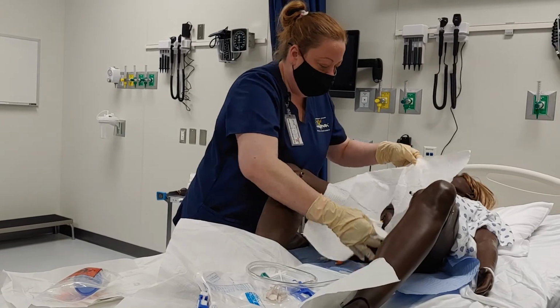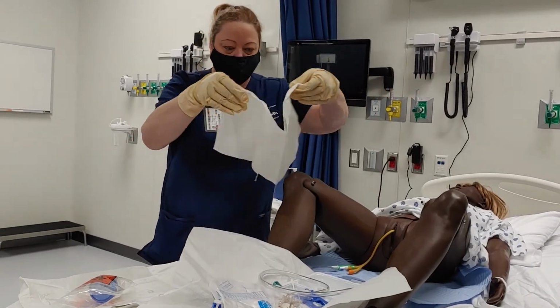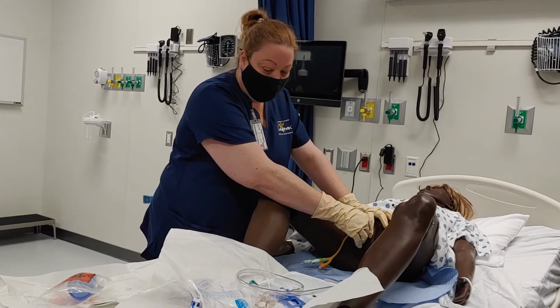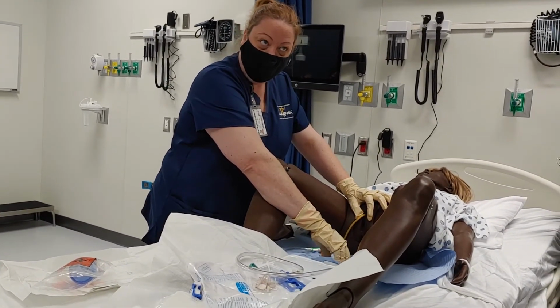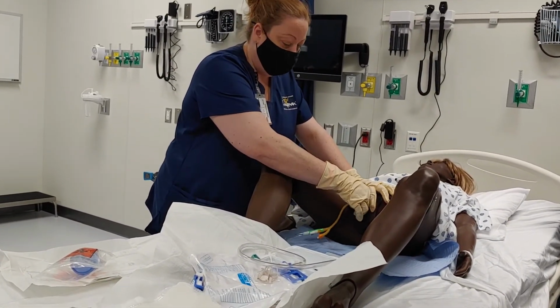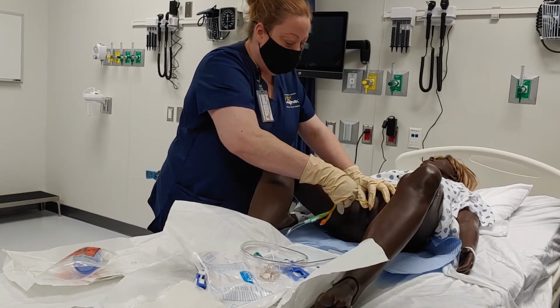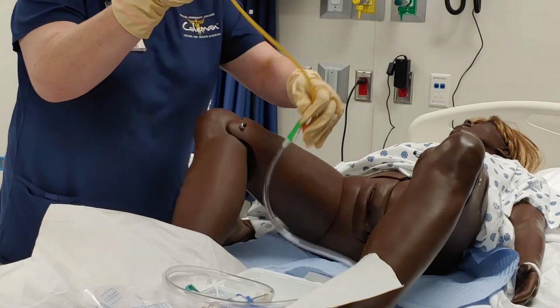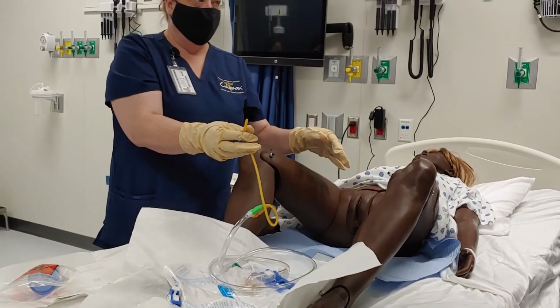But like I said, this anatomy is a little bit more firm than we're used to using here. Then we're going to go ahead and slide it out. Make sure you have that absorbent pad under there because it's going to pull some urine with it. Go ahead and slide it out. Okay, and that's all there is to it. Remove it, clean them up.